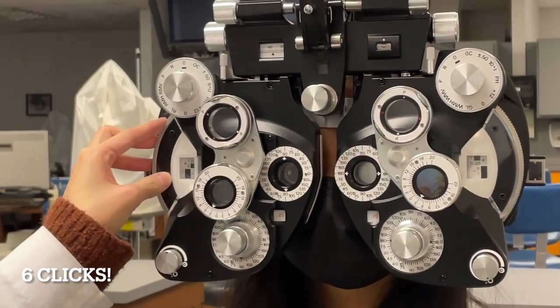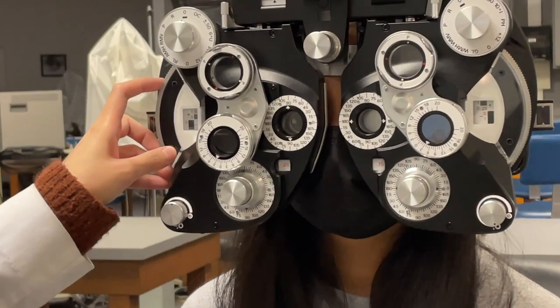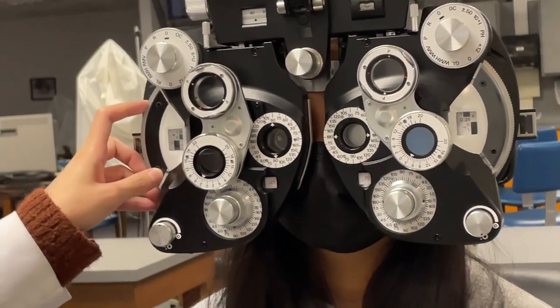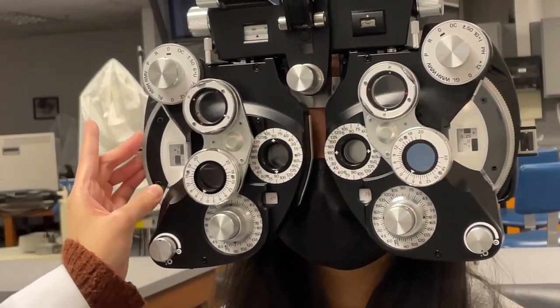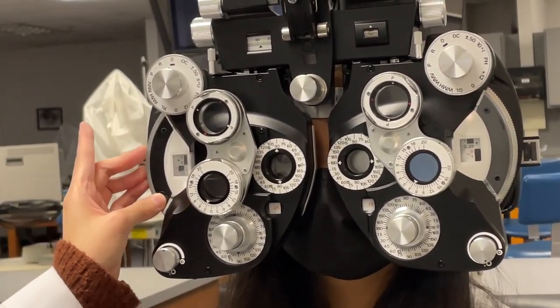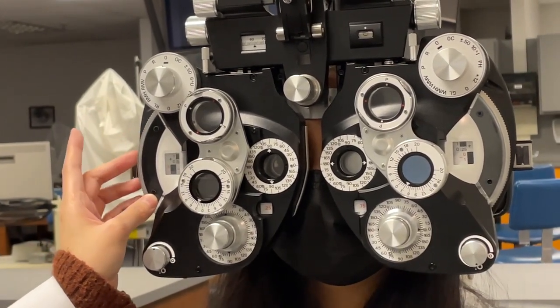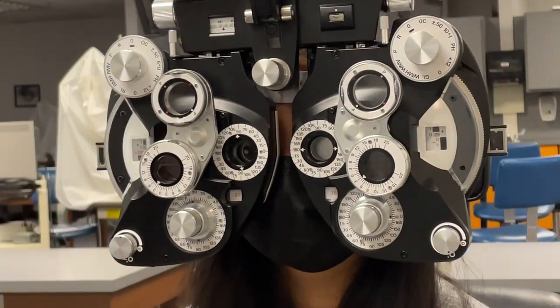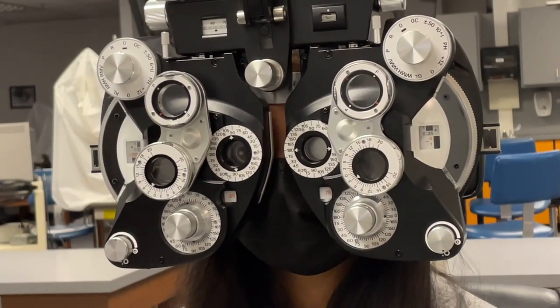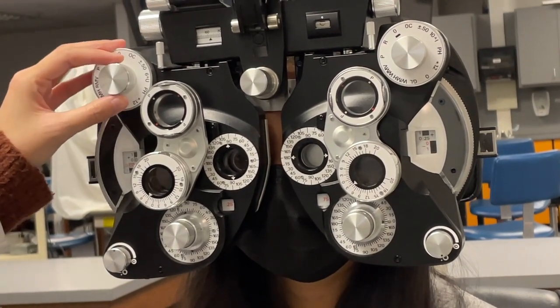All right, Mrs. Lee, that line should be completely blurry to you. Is that correct? I'm gonna slowly move the lens. You let me know when you can just make out 1 or 2 letters, but nothing more. I see an H. Good. Where is the H? At the end. Good. All right, Mrs. Lee, can you read the entire line for me? Yes, it's TEGADH. All right, that's going to be a 20-20.